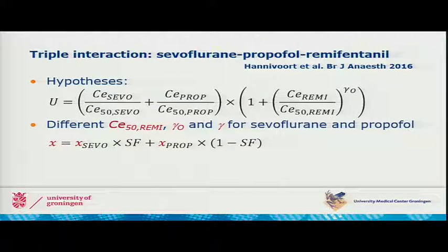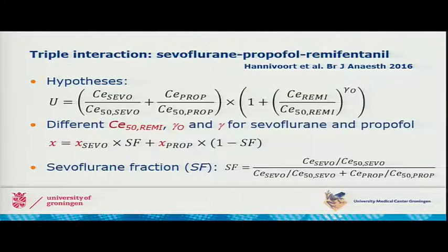So our hypothesis was that these values would be different in the eventual model as well, where each parameter could best be described as a combination of the parameter for sevoflurane and for propofol, depending on the fraction of sevoflurane used in the total propofol-sevoflurane mix.